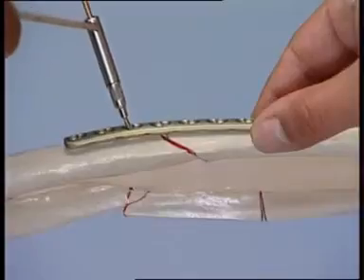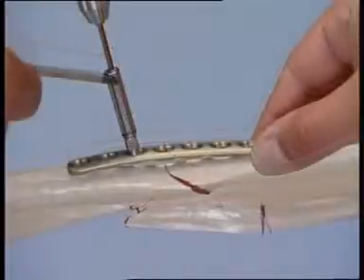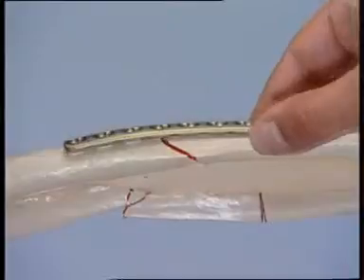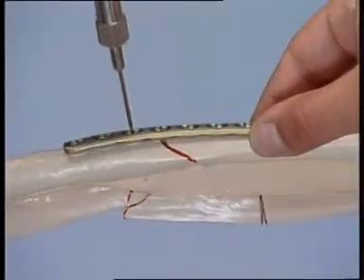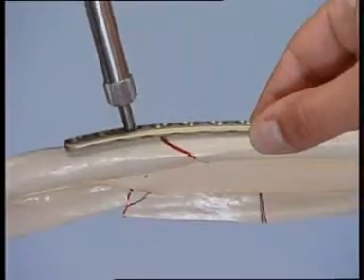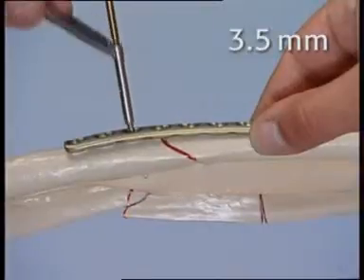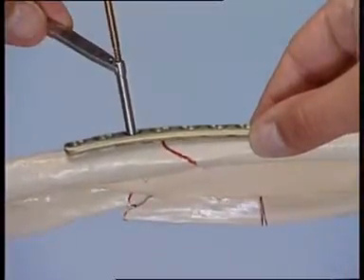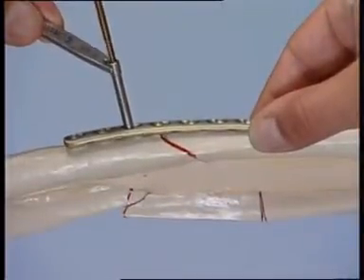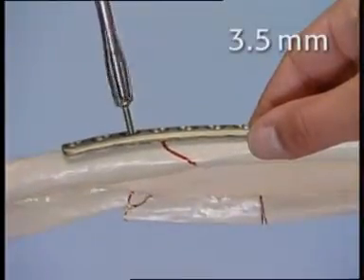The first screw hole is proximal to the fracture and close to the obtuse angle. It is drilled neutrally with the 2.5 mm drill bit through the universal drill guide. The screw length is measured with the depth gauge. The thread is cut with the 3.5 mm tap and the appropriate sleeve. The plate is fixed with the first 3.5 mm cortex screw.